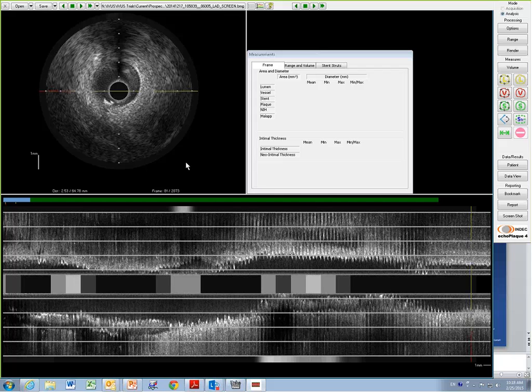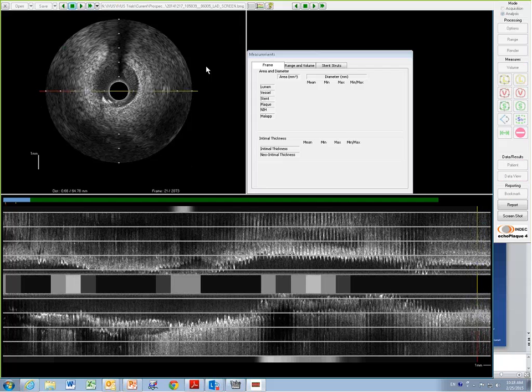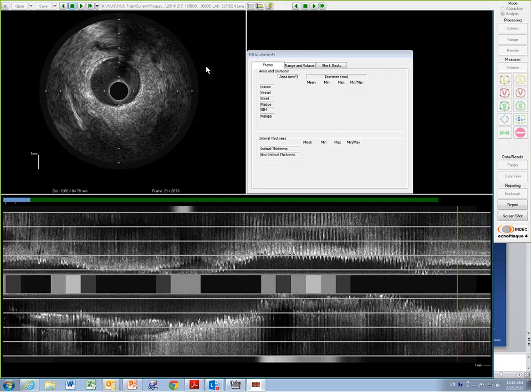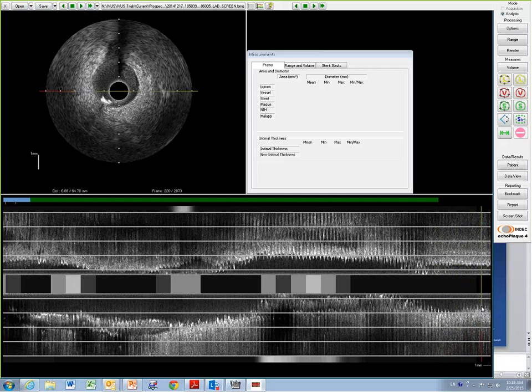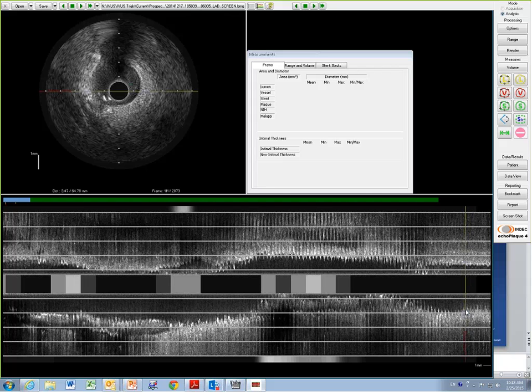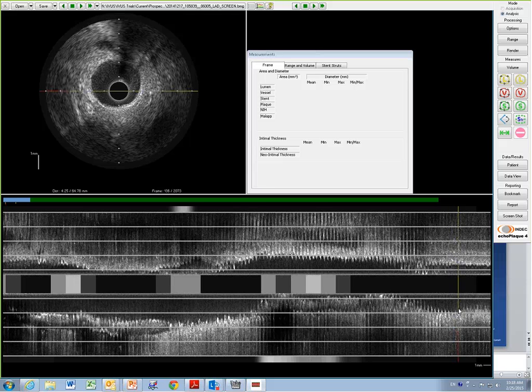I think the information you have here, I didn't do the case, I just saw the IVUS. And I totally agree with you, because this is a situation which is not uncommon. The picture you showed earlier, the schematic drawing with the hematoma, that's a fairly common situation. And it's interesting, and also debatable, how long should I stent? Should I cover the hematoma? I think for those things we still don't have a super clear answer.